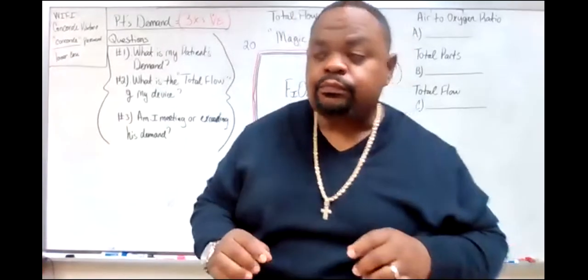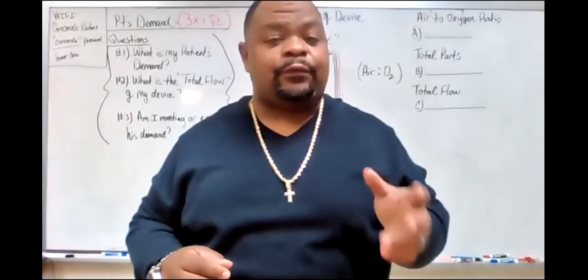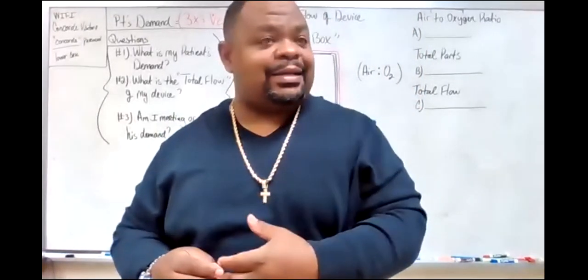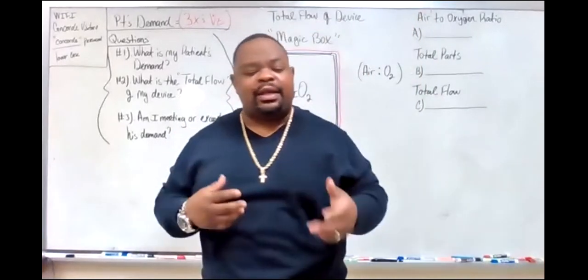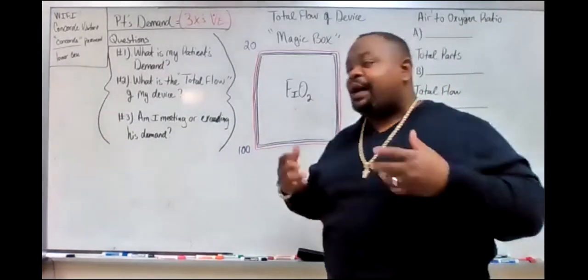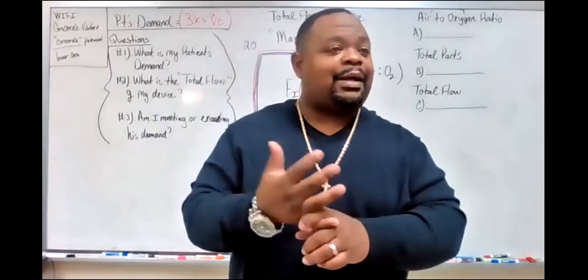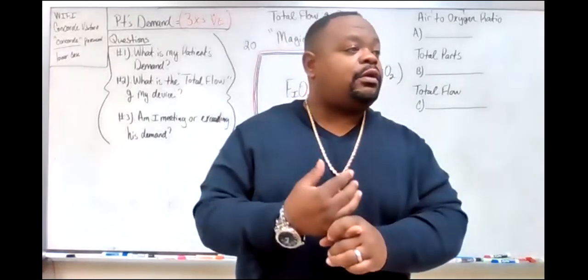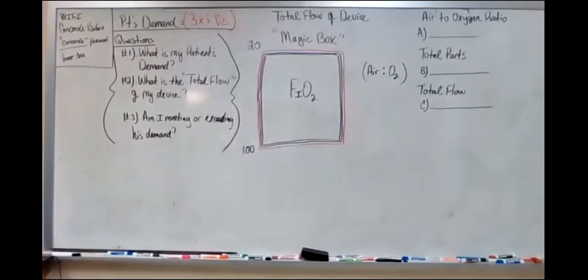We're back. When I have a patient that does not qualify for a low flow device, now I need to go into a high flow device, okay? So as we think about what we learned, we give oxygen in order to treat three different things: either to treat hypoxemia, decrease the work of the heart, and decrease the work of what? Breathing. The lungs.